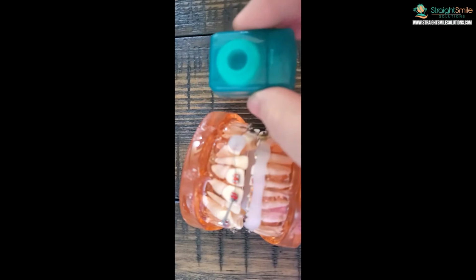So these can be washed and reused, but I think after a week or two, if you wash it, you're going to have to throw them away and get a new one. So you're going to need a lot of those. All right. Last but not least is kind of the hardest part, which is the floss threaders. Get your regular piece of floss. Let me move this so you guys can see this. Any type of floss will do, whatever one you like.